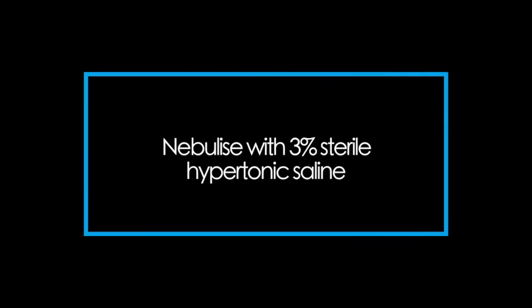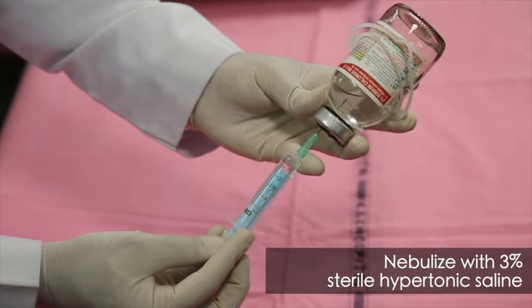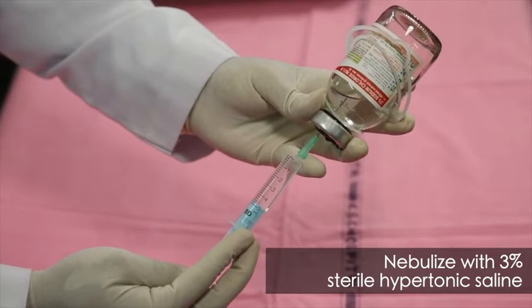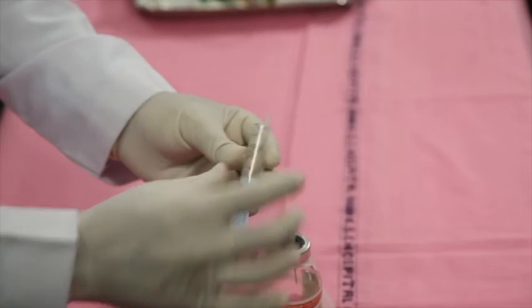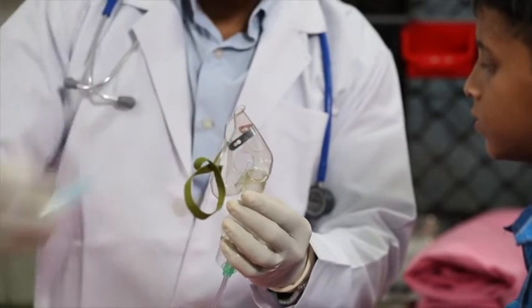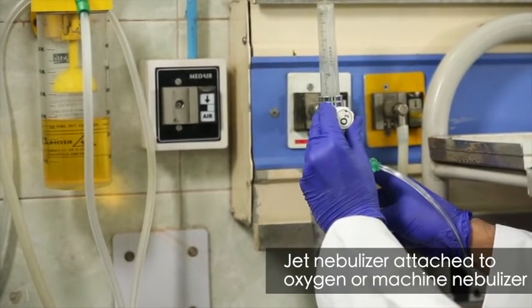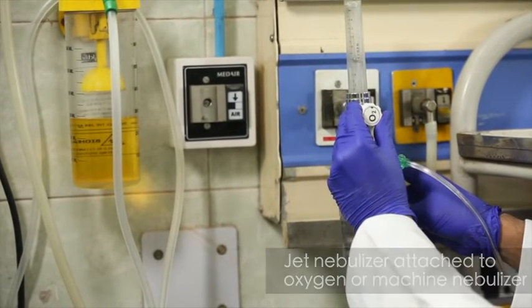The next step is to nebulize with 5 ml of 3% sterile hypertonic saline, using a sterile commercially available preparation. Nebulization is done through a jet nebulizer attached to a pressurized oxygen or air supply at the lowest flow rate needed to produce adequate mist, which is usually 5 to 7 liters per minute.